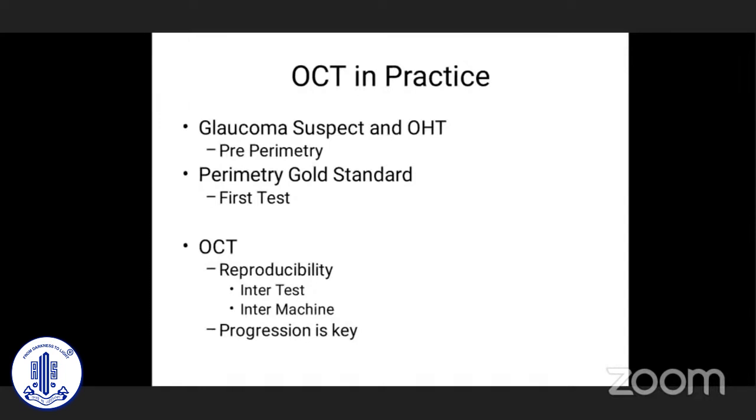So the problem with OCT, why we cannot depend on OCT alone in a glaucoma suspect or ocular hypertension in a first test: you can't depend on it, because the problems are with the reproducibility. That means if you do the OCT test in a patient today, and if you repeat it after say half an hour, the report generally is different.